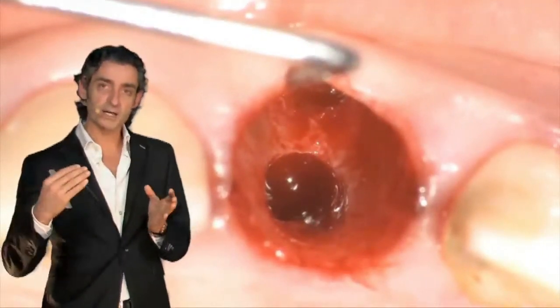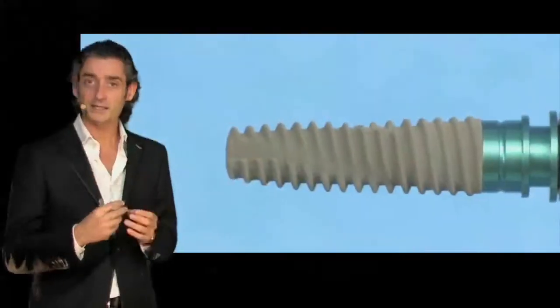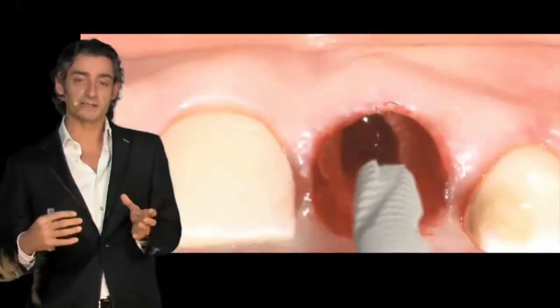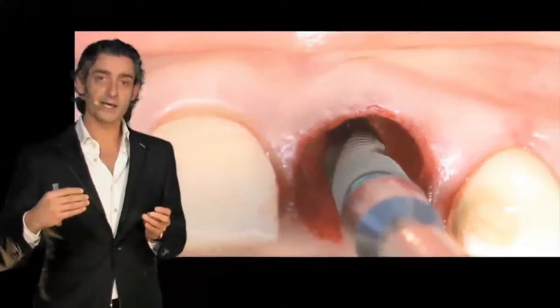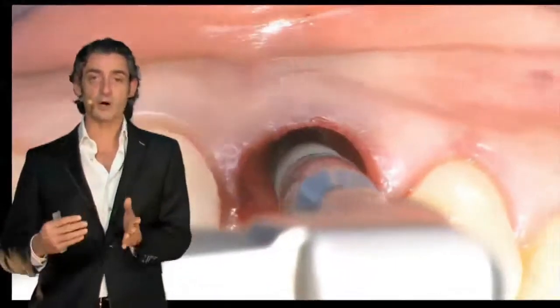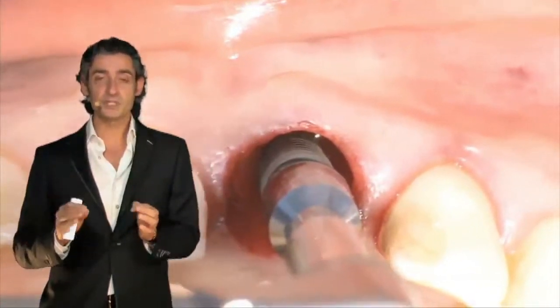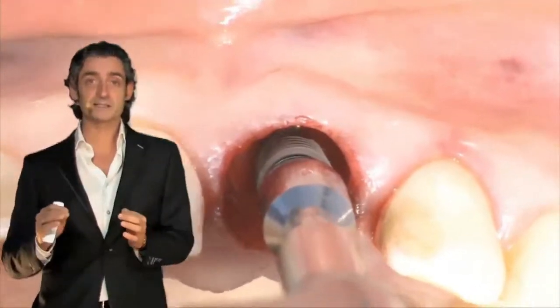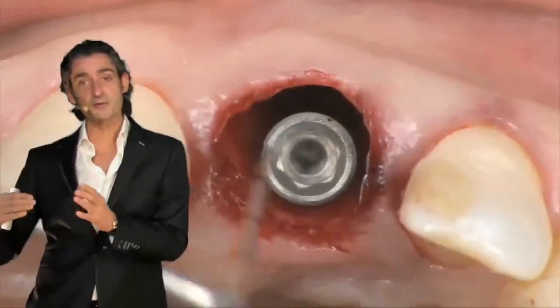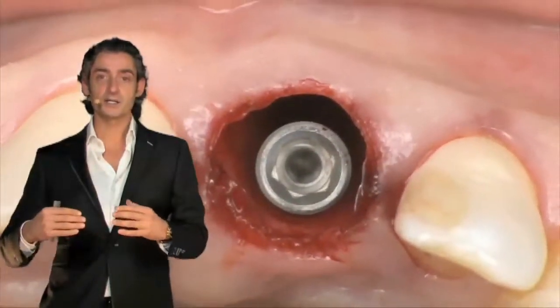Sometimes we can start from the buccal side, because normally we use an aggressive, corkscrew-shaped implant, an implant that can maintain and achieve really good stability in the bone. And so we can get in and then move a little bit just to create the perfect axis of our implant. Then it's important to calculate exactly the position of the neck of the implant. We know that it must not be too deep, not over 2.5 or 3 millimeters from the future free gingival margin, as you can see here, and no contact at all.